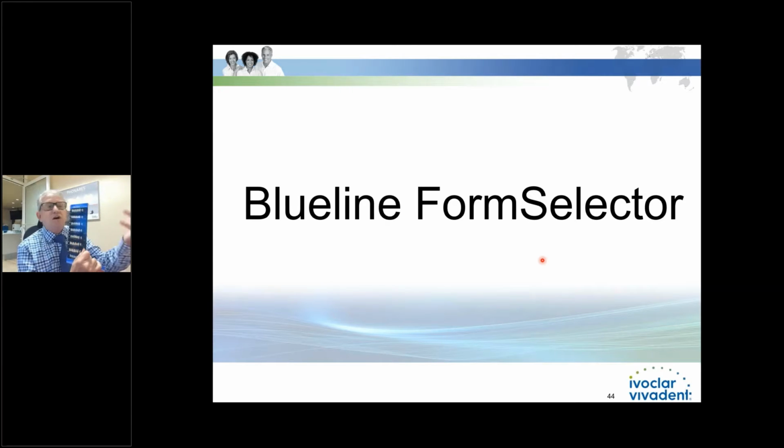Why? Because we just automatically take an impression of the cast, and then we just send it to everybody, and we just keep moving. It doesn't even do us justice to just keep copying people's old casts. This way, you'll find out that a lot of the patients will say, I like this one. And you go, why do you like that particular mold? Why did you pick an A36? And they'll go, my daughter has teeth like that, or I have an uncle, or my father had gorgeous teeth. And that's the shape they were.